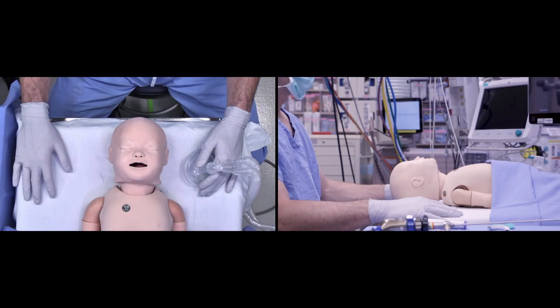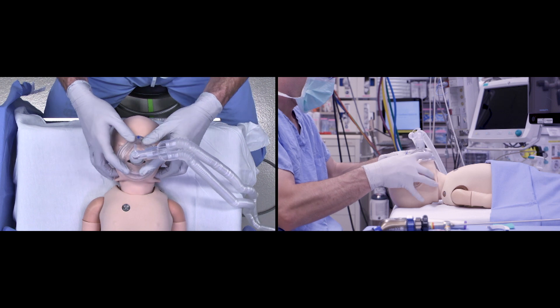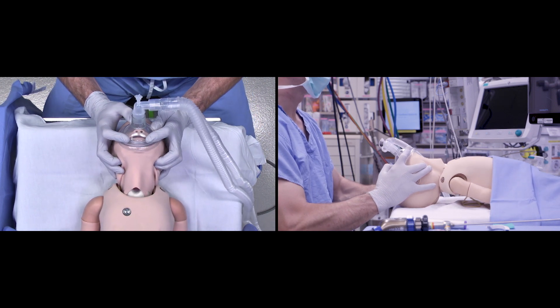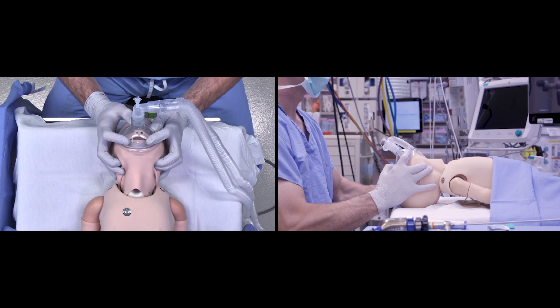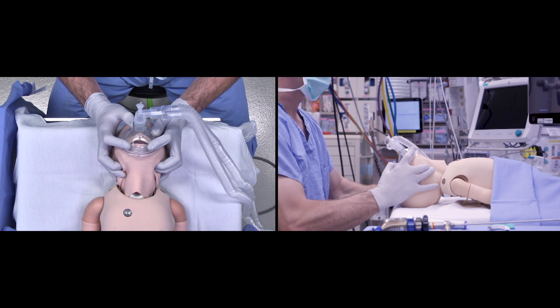In airway emergencies, the airway should always be in the hands of the surgeon at all times — thus we hold the mask for induction. The top of the head should be at the level of your xiphoid approximately. Once the child is under adequate anesthesia, a jaw thrust can be applied. It's important not to have the fingertips medial to the mandible, as soft tissue compression can completely occlude the hypopharynx and supraglottis. This will allow the anesthesia team to place an IV if one hasn't been done yet.